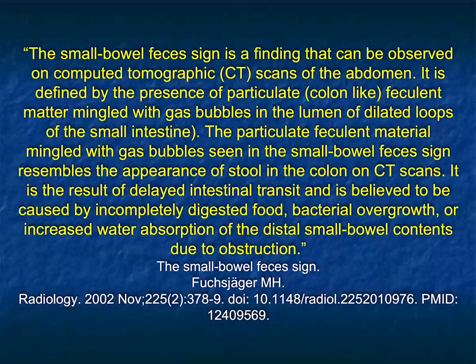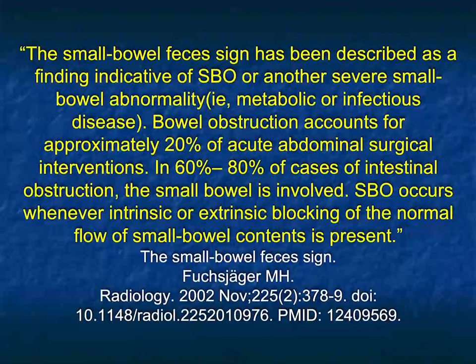And again, in that article, the comment was it is a result of delayed intestinal transit and is believed to be caused by incompletely digested food, bacterial overgrowth, or increased water absorption of the distal small bowel contents due to obstruction. But when you see it, it's a very, very specific sign.